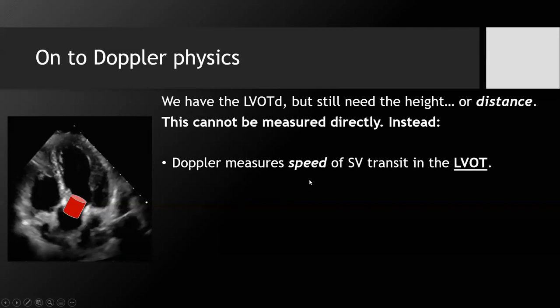So instead, what Doppler will do is, and you don't really have to know calculus, but knowing of calculus is nice. What we'll do is you'll choose the spot on your apical 5-chamber view.